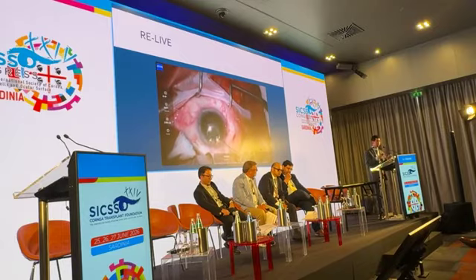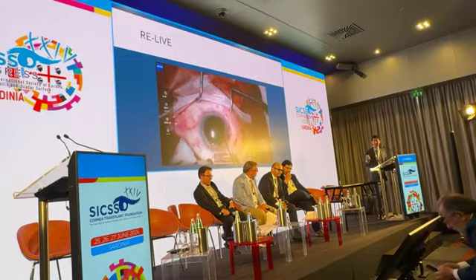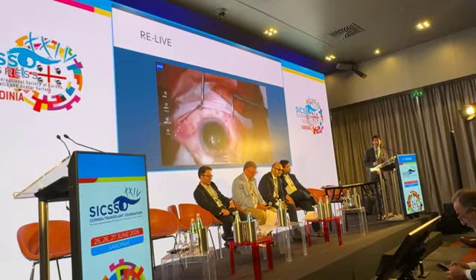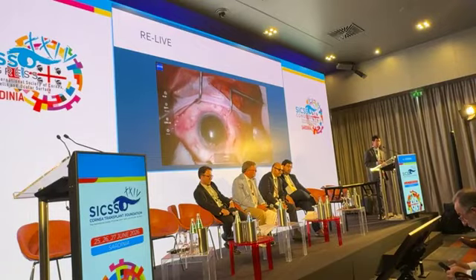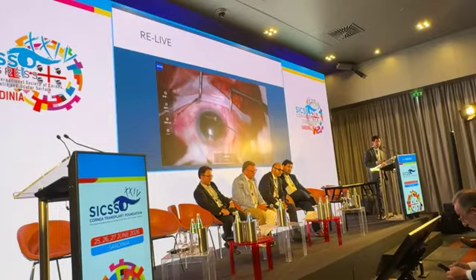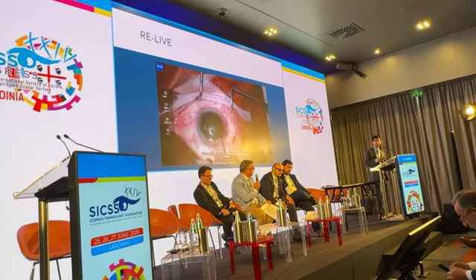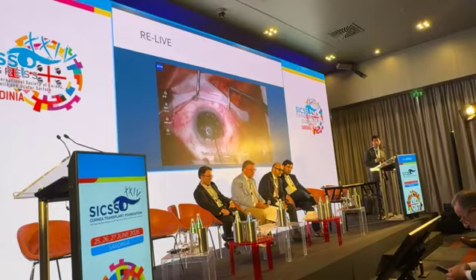Once this is smoothed out, you let it dry in place for about, I leave about 5 minutes. They recommend at least 2 minutes. I think you even use 10 minutes, Ed, right? Yeah. And it's pretty stuck on there, pretty adherent if you leave that amount of time. Because really the only complication is graft dislocation, so it's got to be really, really dry and adherent. I mean, you want to avoid that at all costs.